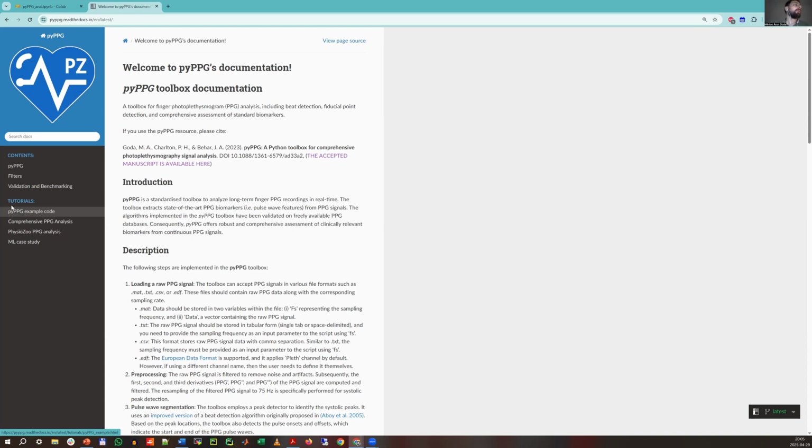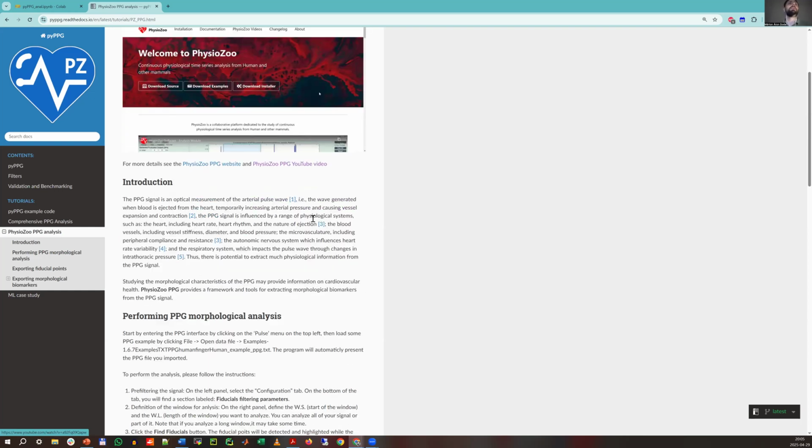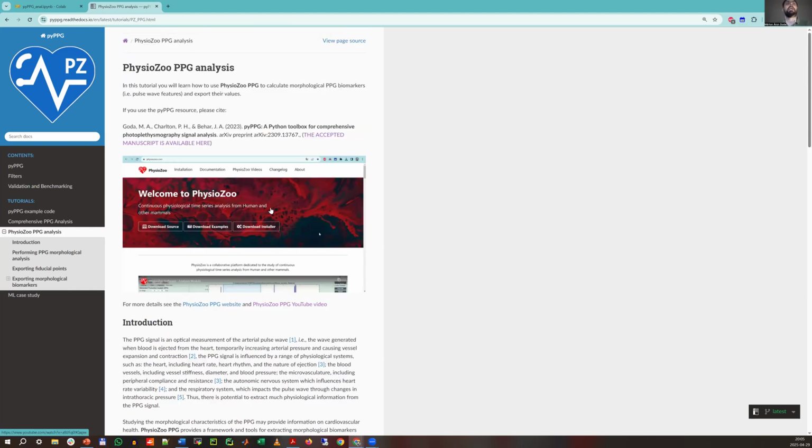It provides multiple physiological signal processing analyses, and it's integrated in Python and in MATLAB. So if you are more comfortable working in MATLAB, then it can be very useful. So previously, I made a short summary about the pyPPG, which is integrated in the Fiducial. So in the next few minutes, I will present to you this short video.